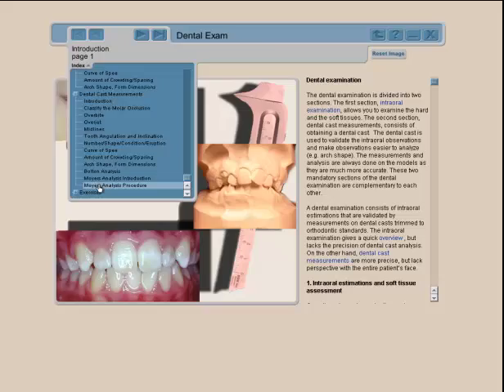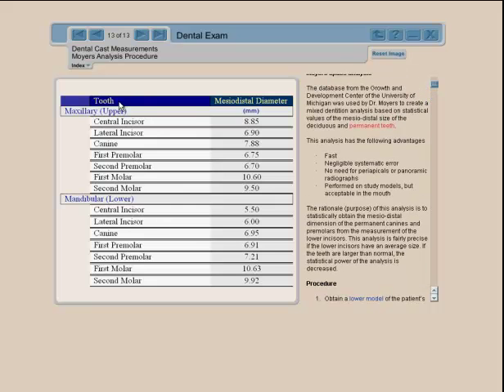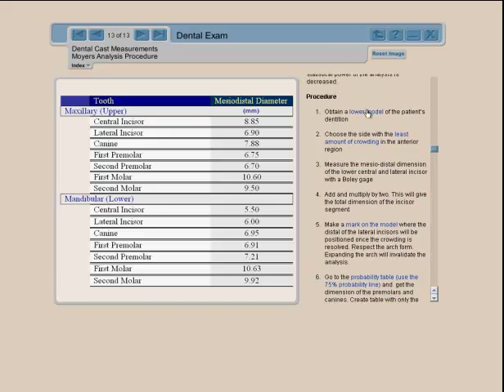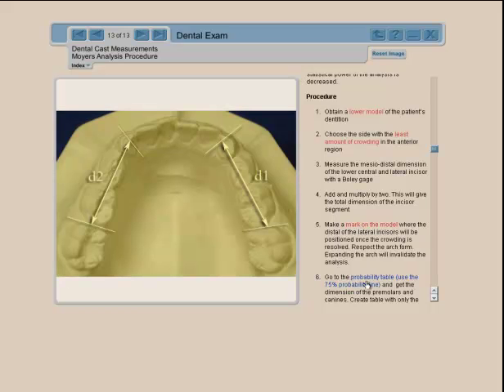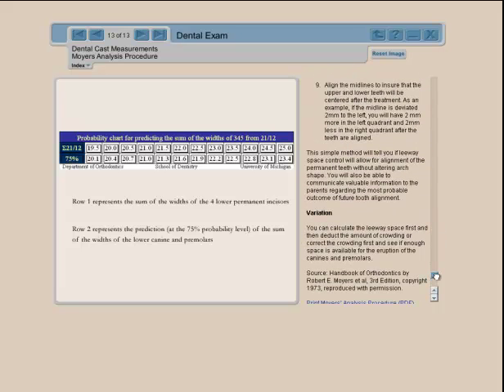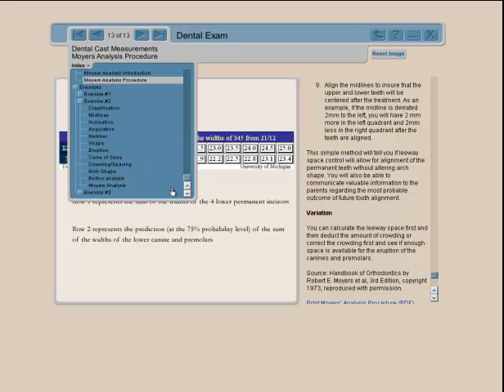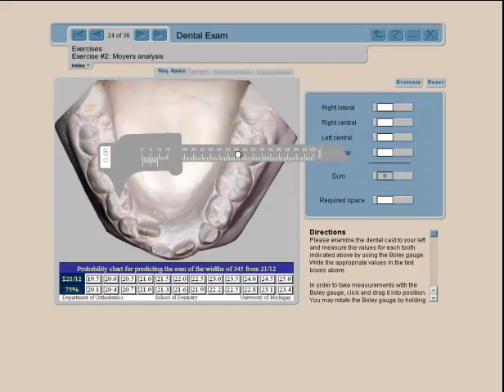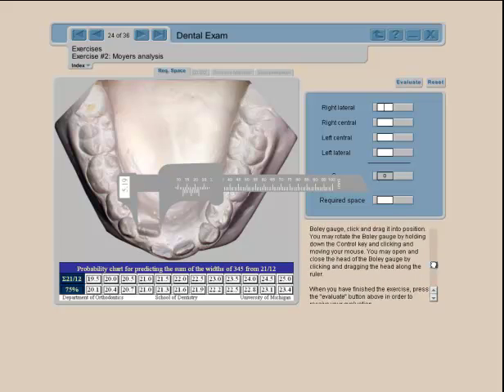For dental cast measurements, let's look at the Moyers analysis procedure. We provide tables where needed — in this case a tooth size table — and show you how to work with a Moyers analysis. Once you've mastered the technique, you can go into exercises. You are provided with an electronic Boley gauge to measure the teeth, and the Moyers probability chart is right there along with all directions to perform the analysis.